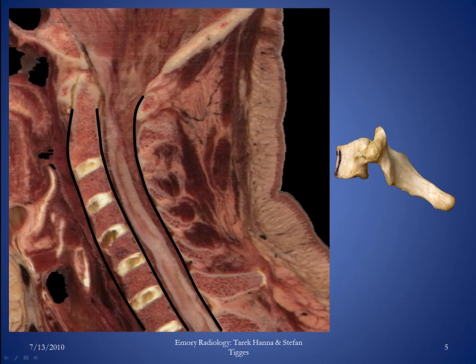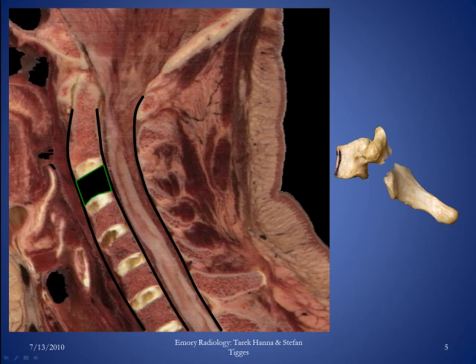Once you've determined that alignment in the cervical spine is intact, look at the individual vertebral bodies themselves. From C3 through C7, make sure the vertebral body heights are intact and the end plates are relatively straight without any deformities. We've outlined the C3 vertebral body in black — you can see how it's relatively square. Finally, make sure there are no obvious displaced fractures or fracture fragments anywhere in the cervical spine. So: check lines and alignment, check vertebral body heights for compression, and check for displaced fractures.